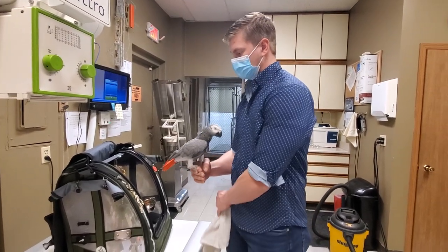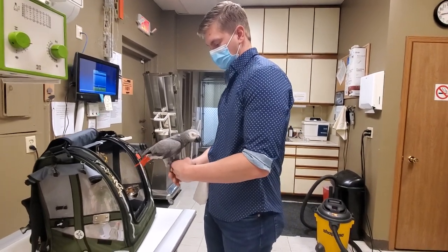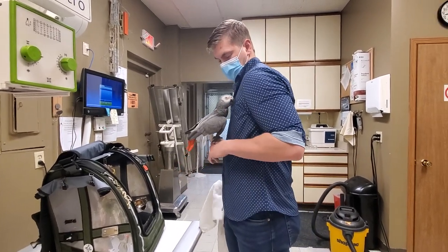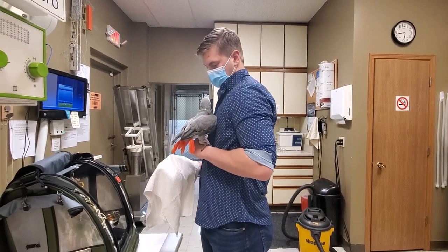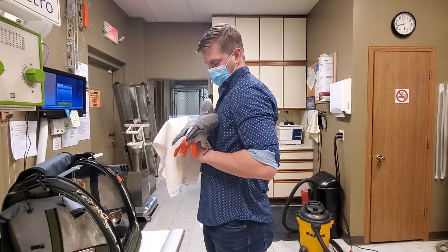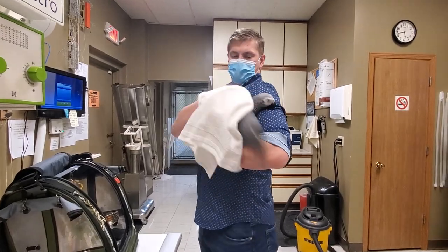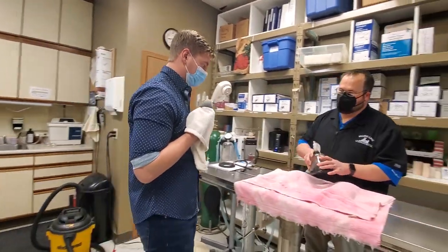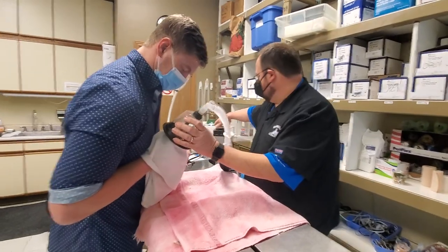Okay. Here. That's your chance. Good job. Good job. Good job. I know. I know. I know, it's alright. You're okay. You're okay, Heidi. You're okay, Heidi.